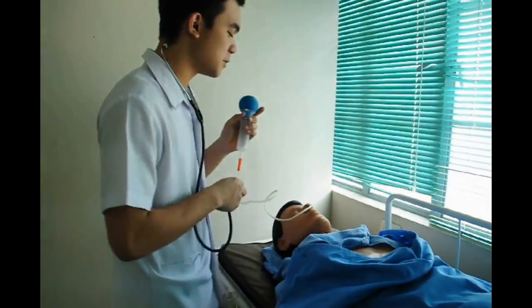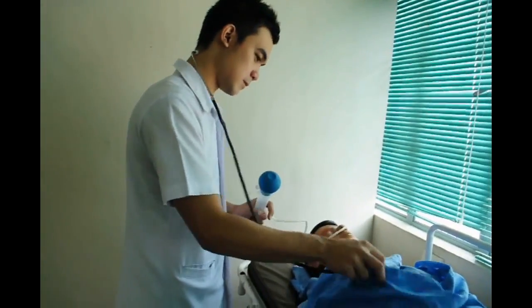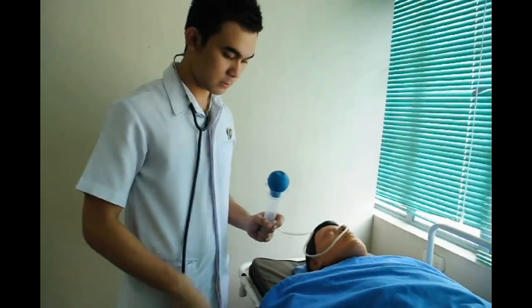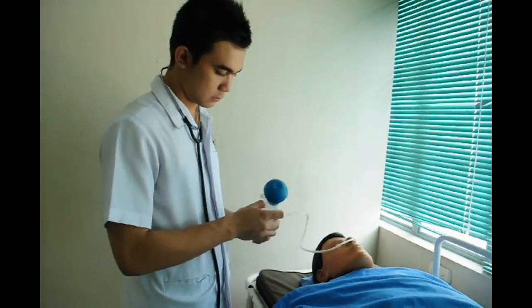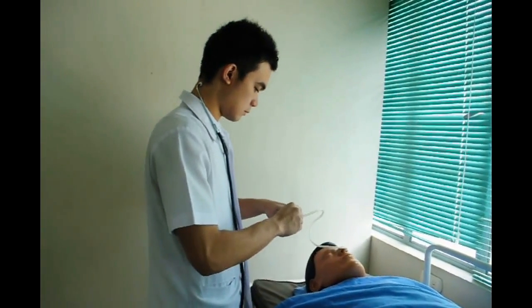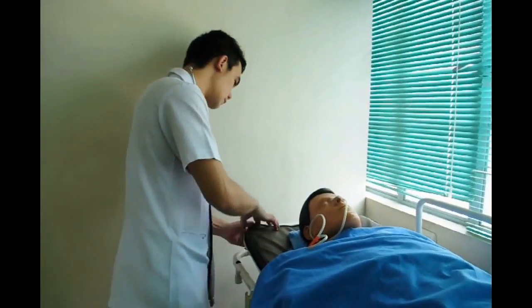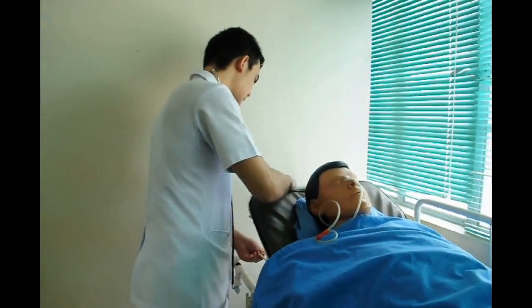Good. The tube is in proper placement. Next, Nurse Kelvin is going to elevate the head of the bed 30 to 45 degrees, or as near normal position for eating as possible. This is to avoid aspiration. Sir, I'm going to elevate your head.